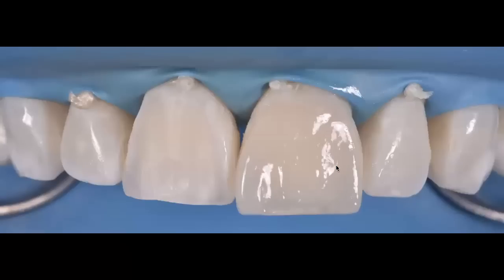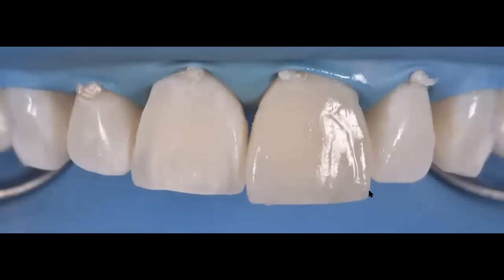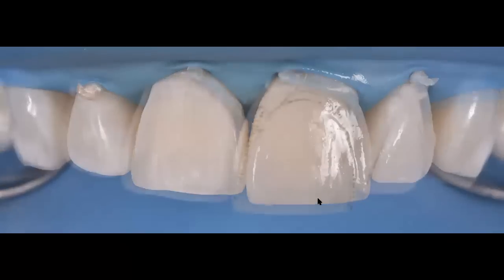And now I'm ready to add my final facial enamel layer, and you can see it right here. So I have completed the restoration on tooth number 9. I'm now going to start what I call the pre-finishing of this composite layer, composite veneer, I'm sorry. I'm going to make sure that I get the right length. I'm going to make sure that I get the right mesial distal width by playing with my line angles. And again, it's just a pre-finishing.